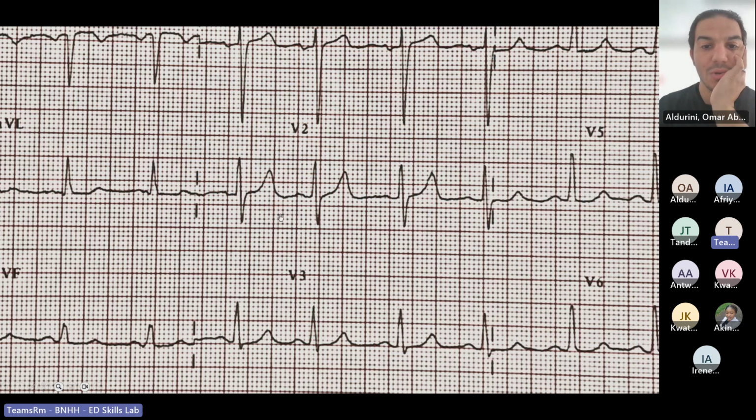How wide do you think it is? After the QRS, it's more or less a T wave, this one. You are speaking about the size of the T wave.